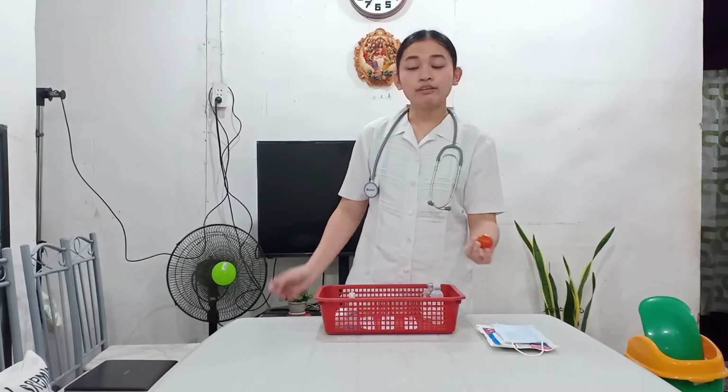I have here a tomato because I cannot administer parenteral medication in this return demonstration without the supervision of a licensed nurse. I will be using this tomato, assuming that this is my patient for today.